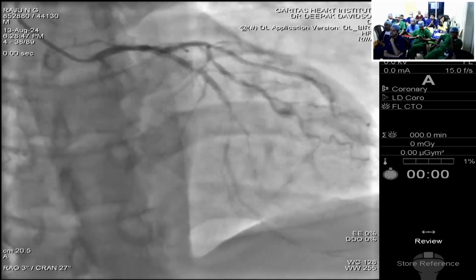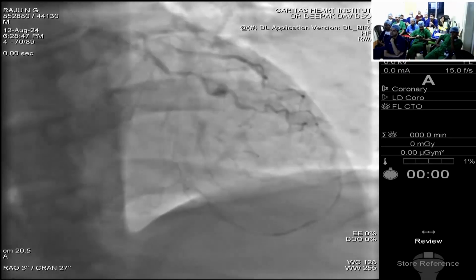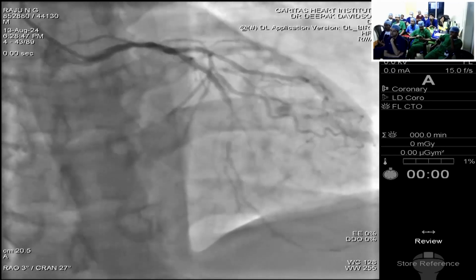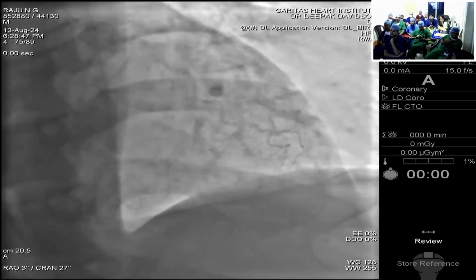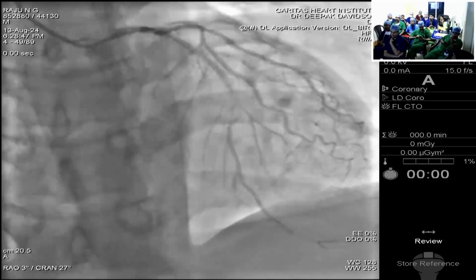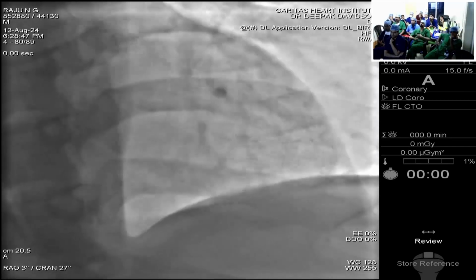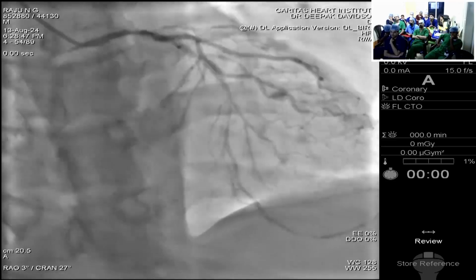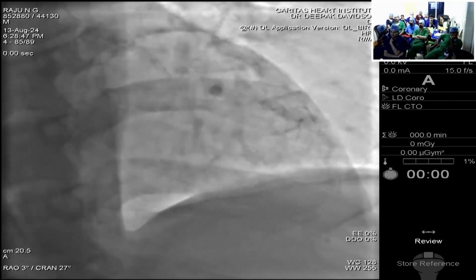It is tapering and narrow. It's a diffusely diseased vessel. Maybe the lumen appears to be reasonable, but if he didn't have these sort of lesions over here, we would have just opted for medical management for him. But if we had to do that distal lesion, then otherwise we would destabilize all those particular areas. So that's what we'll do.